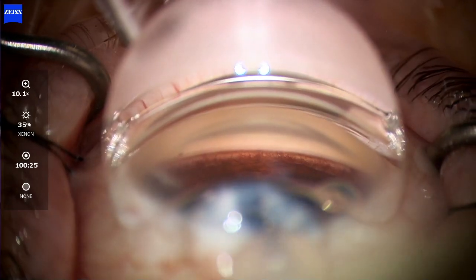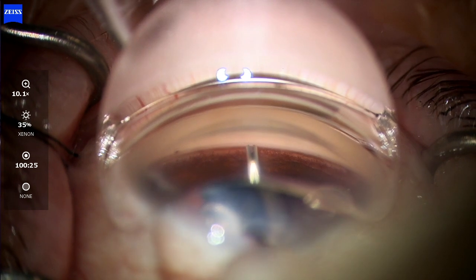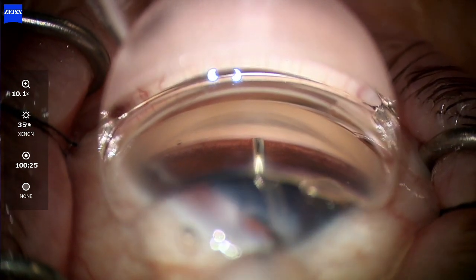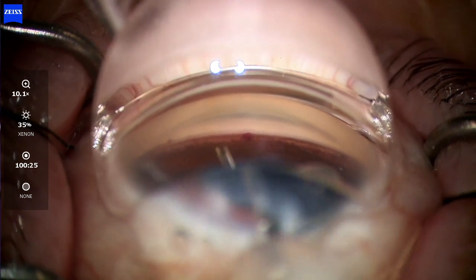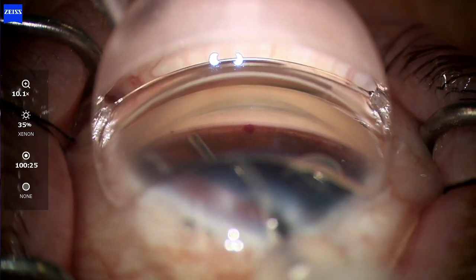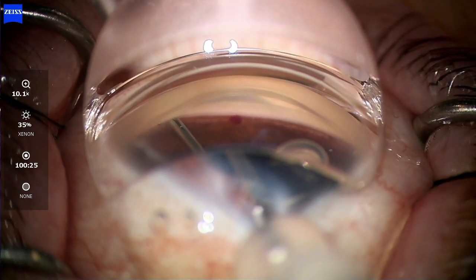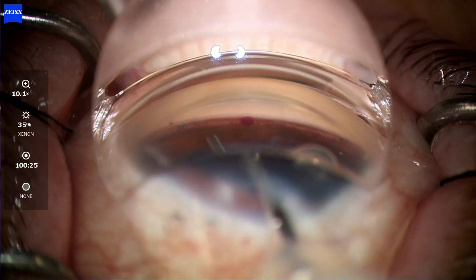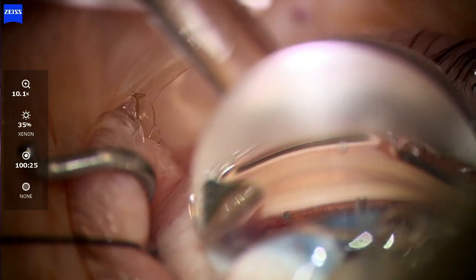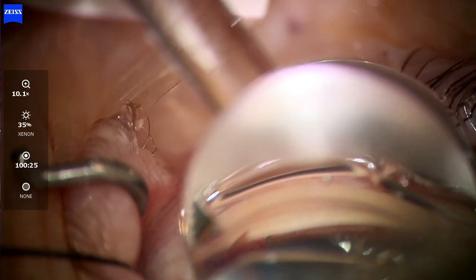Now looking at the actual video: here we're entering and placing our first stent just like a normal i-Stent Inject W — press, hold, and come back. What's cool about the i-Stent Infinite is it doesn't have a jackhammer-like action pushing the stent in. Instead, it pushes with constant contact, which I find results in less chance of the stent bouncing back into the anterior chamber.